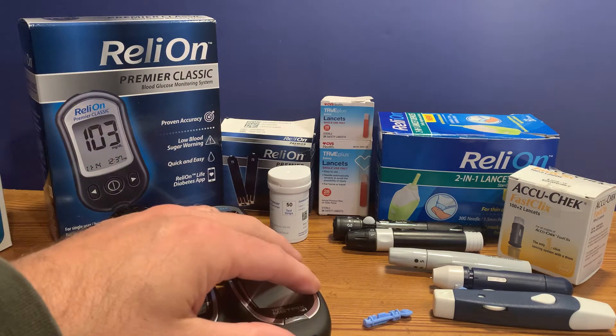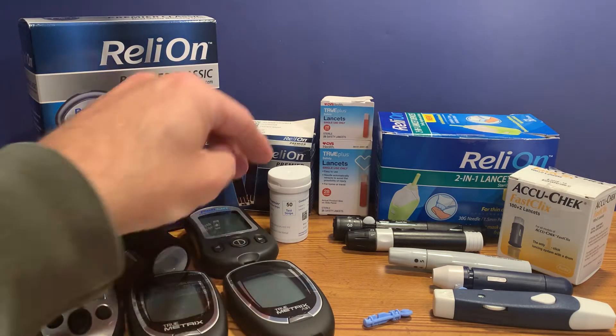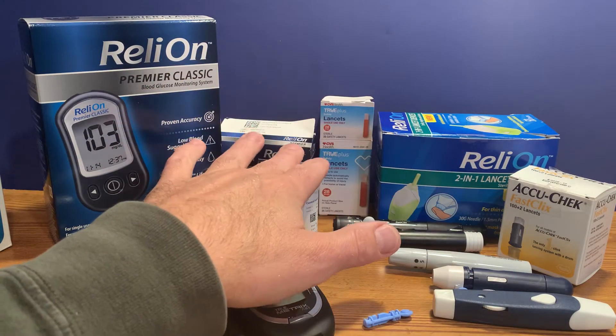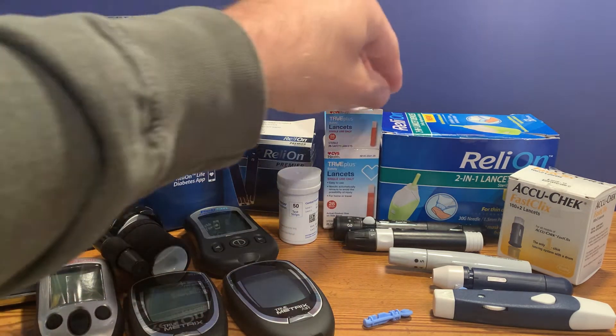To perform a blood glucose test, or blood sugar test, you need the meter, the testing meter, as well as the appropriate strips to go with that meter, and a lancet device. The lancet device is simply how you poke your finger to get a drop of blood to put on the test strip.